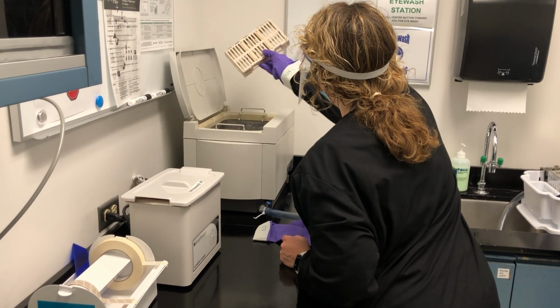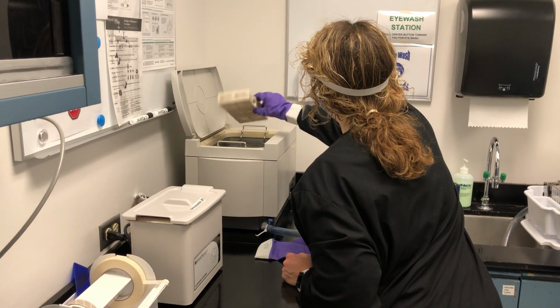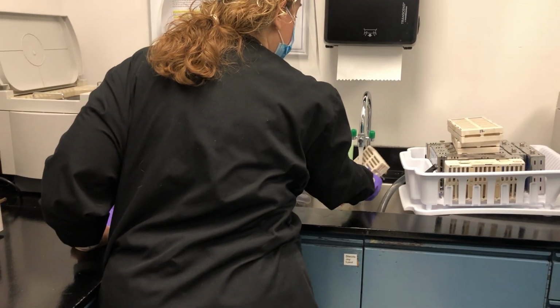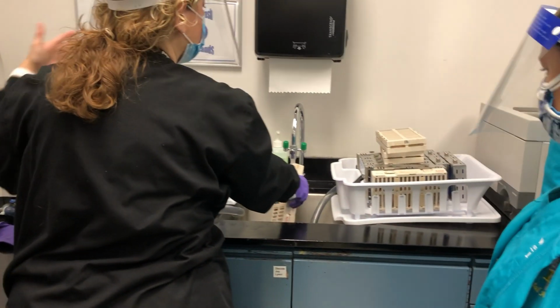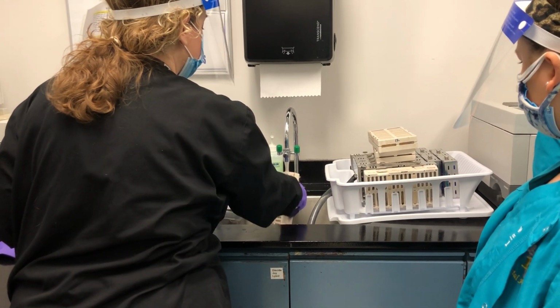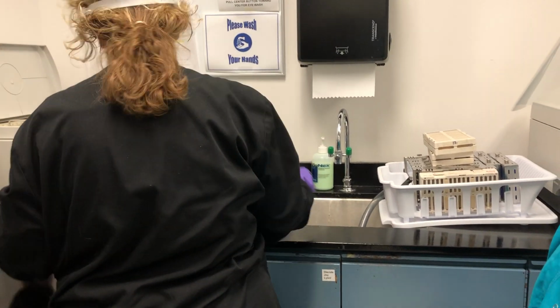And you'll see it'll drip water at first. These cassettes hold a little bit of water. So you just want to kind of move it back and forth instead of sloshing water all over the other trays that are out here. You're going to use the foot pedal just like you do when you're washing your utility gloves. And you're just going to rinse it off really well. There's a chemical in here that is used during the biosonic process that's basically what we're washing off, the chemical before it goes into sterilization. So we just rinse it really well, and we're going to go ahead and put it in the strainer to dry.